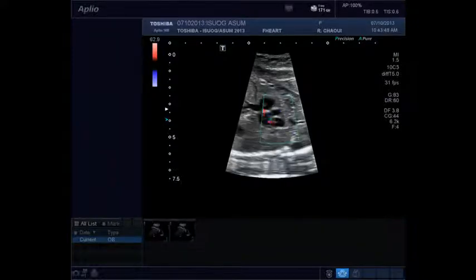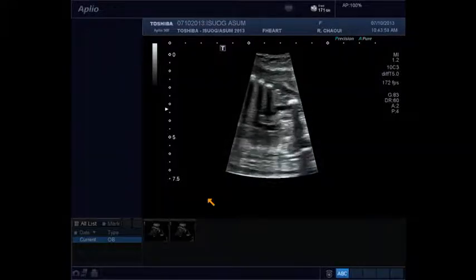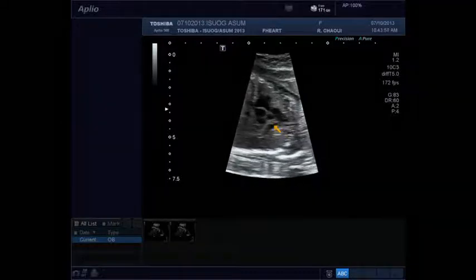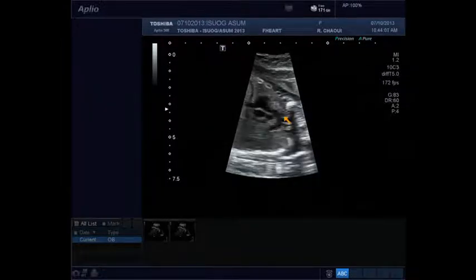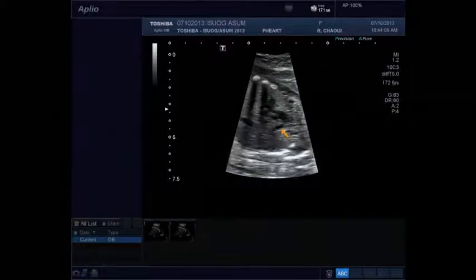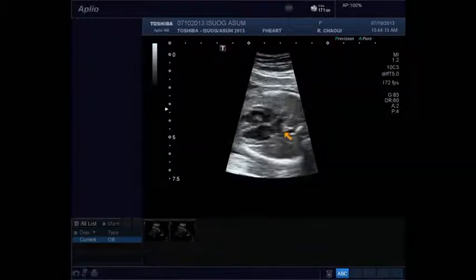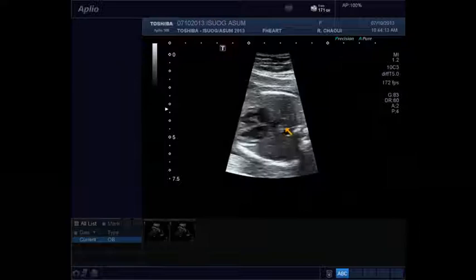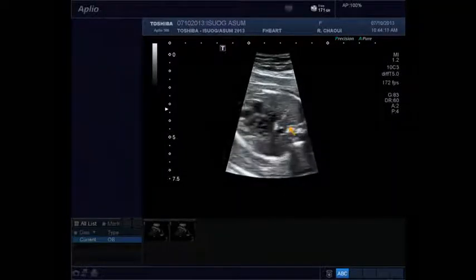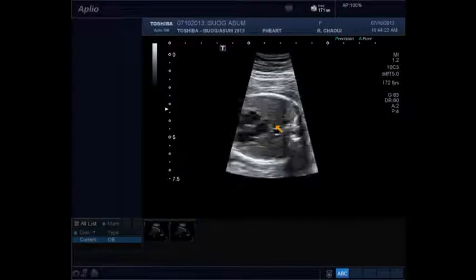In general, in true coarctation, you may have even that the last vessel, which is the left subclavian, will be arising from the descending aorta, and then it would be in this region. That means the region after the 3 vessels have arisen from the aortic arch. So, and this is the esophagus, very well seen behind the heart. The area behind the heart includes mainly the descending aorta, very tiny azygos, and the lung veins.